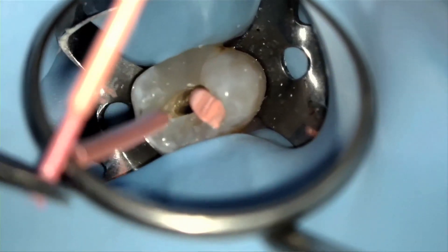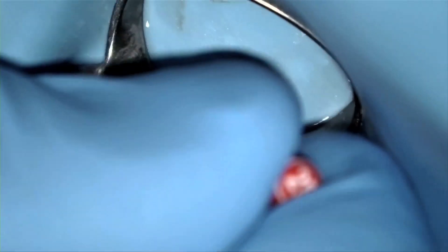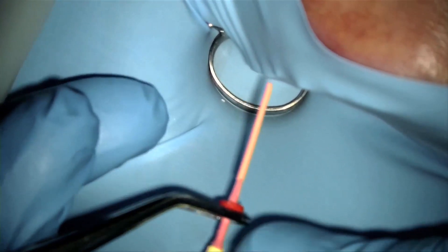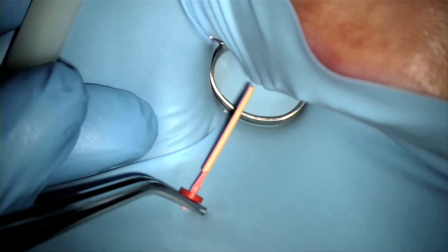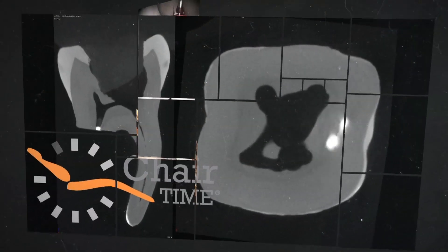To recap, I've shown how you can obturate large ovoid canals, how to manage canals with no apical constriction, and how to easily prepare post spaces and retreat canals obturated with gutta core. Finally, I demonstrated how gutta core stands out above other warm obturation systems by enabling you to obturate so easily in difficult-to-reach sites. I hope you found this useful. Good luck and thank you for your time.